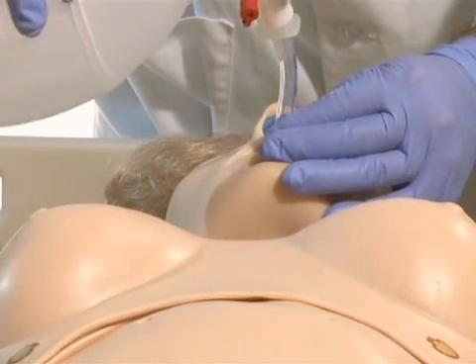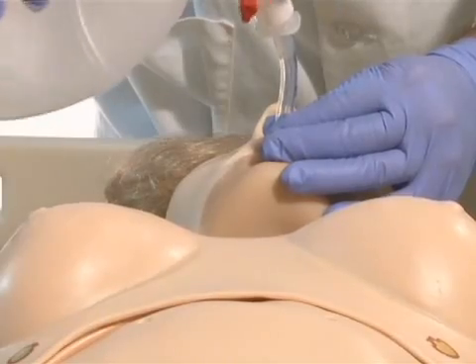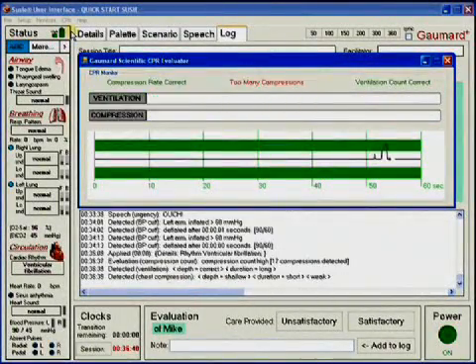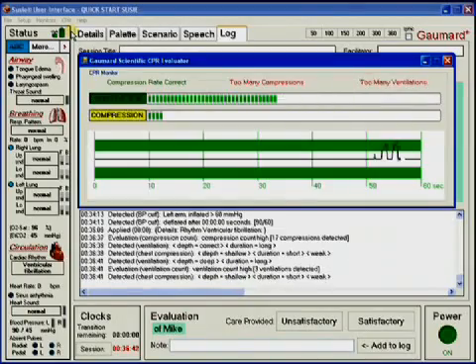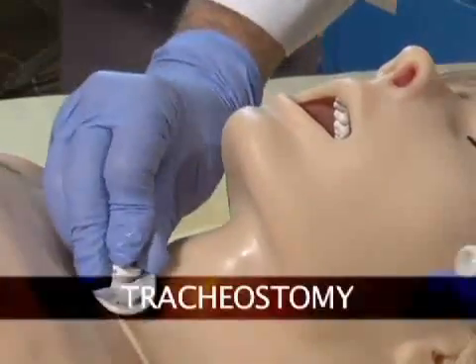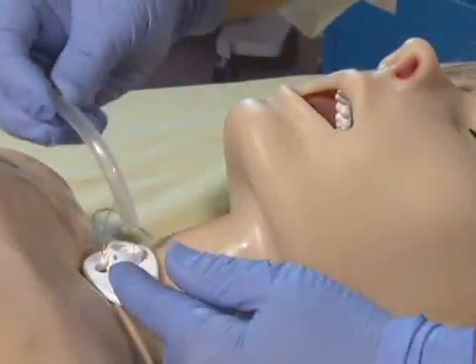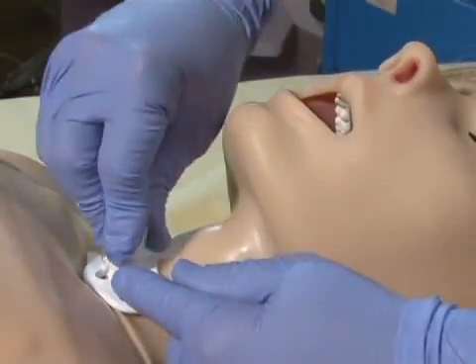Correcting the tube position enables the left lung. Ventilations are measured in logs, showing the instructor exactly how students are performing. If neither oral nor nasal intubation is possible because the airway is compromised, then a tracheostomy tube can be inserted.